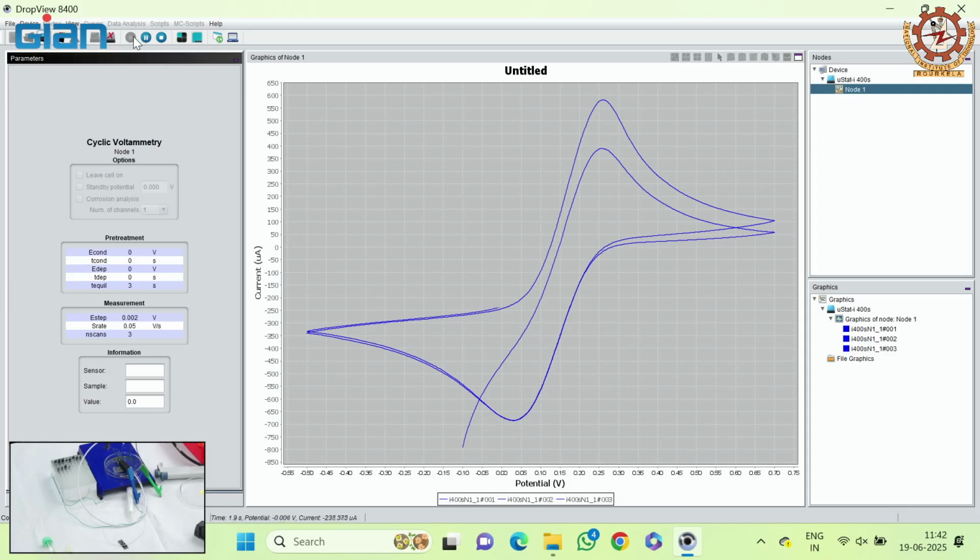The shape of the CV curve indicates that the working electrode is working okay. The oxidation and reduction voltages can be noted down for further analysis if you wish.